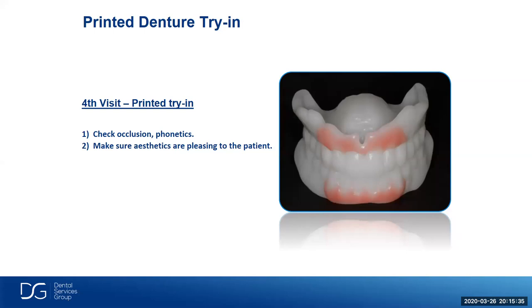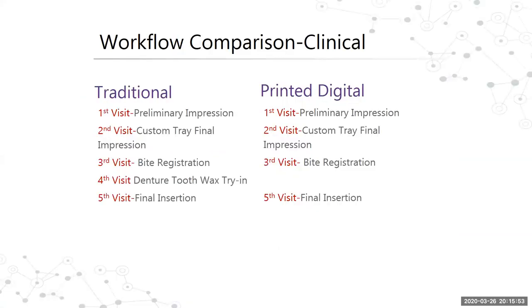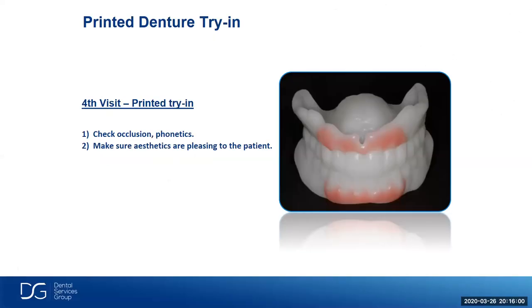So it's kind of a monolithic looking try-in, and we'll talk about characterizing these later on to make it a little more natural. So it takes a little bit of getting used to. But these printed try-ins fit fantastic. It gives you the idea of the aesthetics and function and the occlusion, just as you would with a traditional try-in. And the workflow comparison on the clinical side, everything's pretty much the same except for that fourth visit when we're doing our printed try-in. Again, here's our printed try-in.